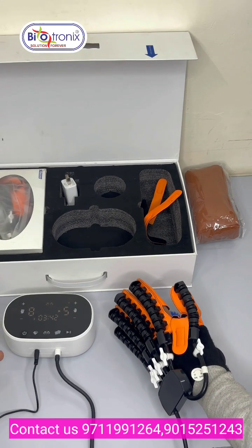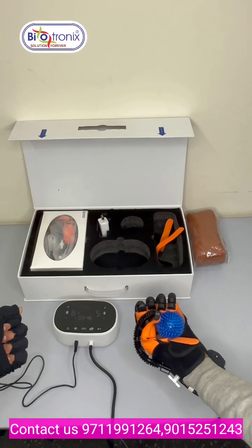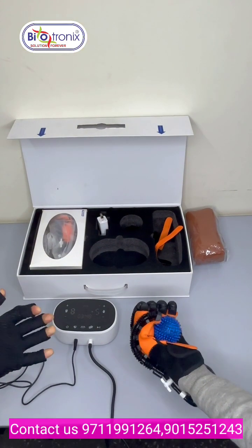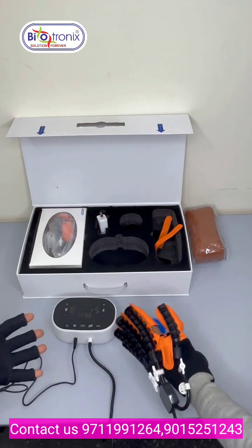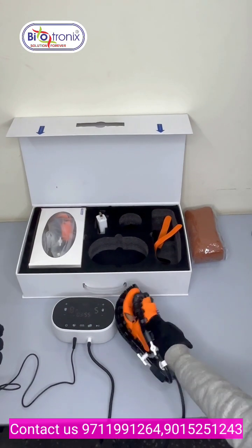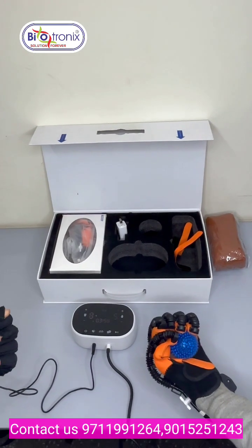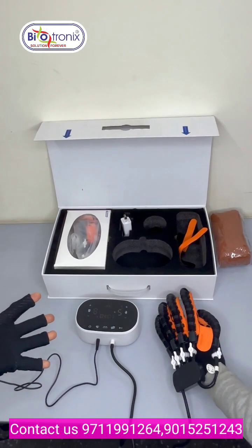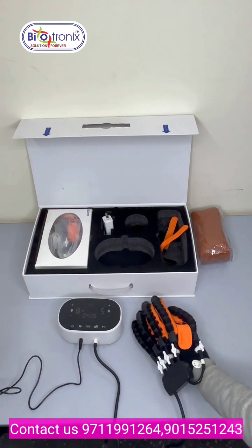Currently it is in the extended position, and now I am flexing the same. You can see the patient can perform the ADL activity here. Now it can drop the same. Again, he can also hold the ball or some glass or some pencil-like things for the daily activity he is using. By this he can also train the ADL activity. So this is the ADL activity training.